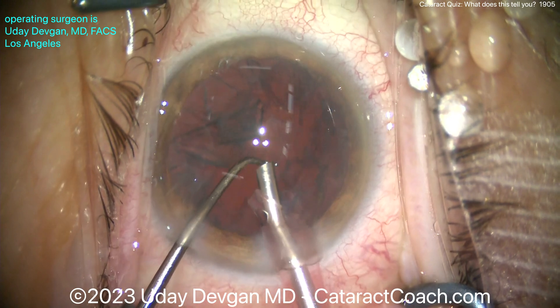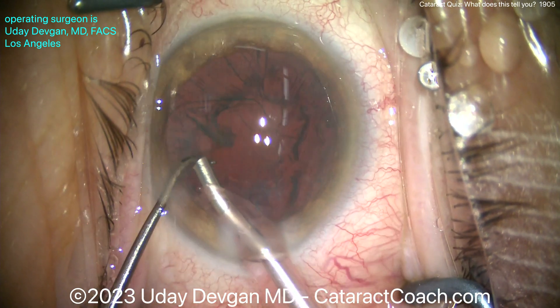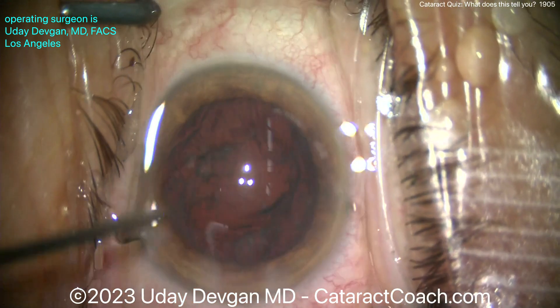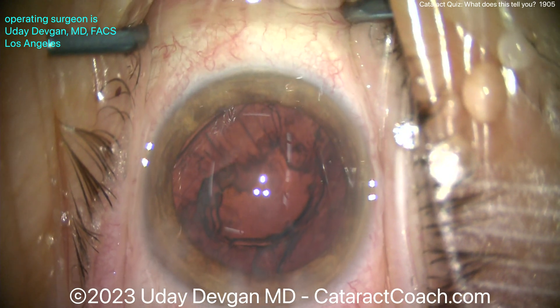Everything looks totally normal. I'm having a totally normal case here, looks great. Everything's fine, right? The last little piece is coming out. All right, come out of the eye — and look at that! I noticed it — do you see it?